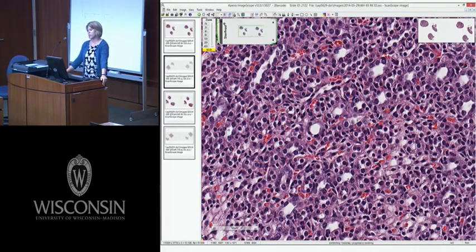And so here we have a screenshot of what typically can be seen with the Aperio slide scanner. Up here in the upper left-hand corner, we have the scanned entire slide. On the right, we have an area that has been zoomed in from within that whole slide section. Further, there's a magnification tool, which is this little dot here that I'm pointing to in the right-hand corner, and that shows you at high power magnification the tissue within that area.